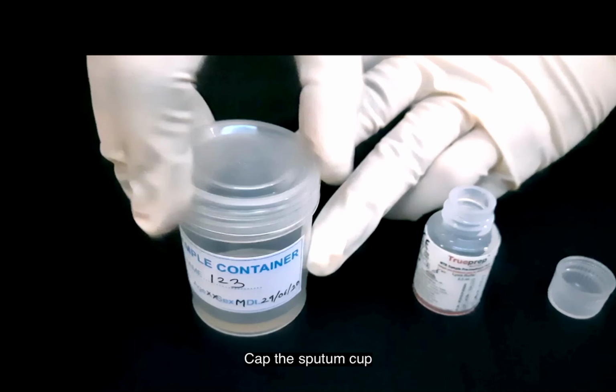There can be a lot of problems which can go wrong. Sometimes you may have to retest, and there are a lot of troubleshooting options where you may have to re-extract. So never throw the sample till the final result is achieved. If you are not able to do this particular test today, say some emergency comes up and you have to go, but you have put this 0.5 ml into the lysis buffer, it's all right.